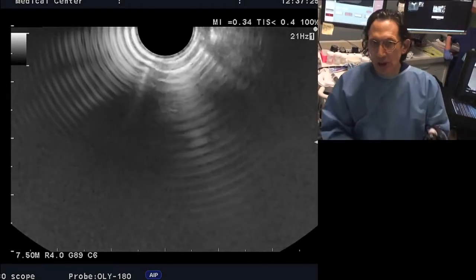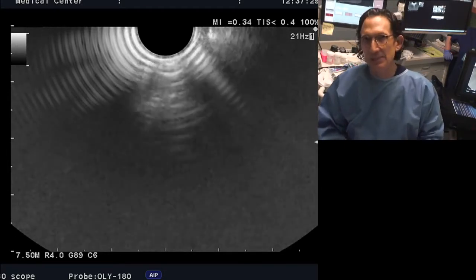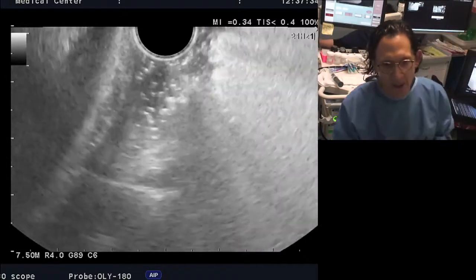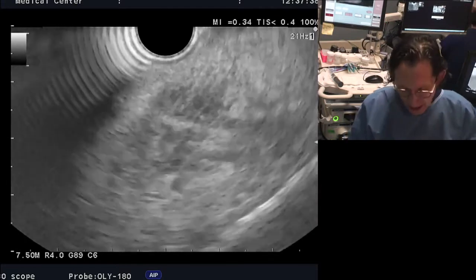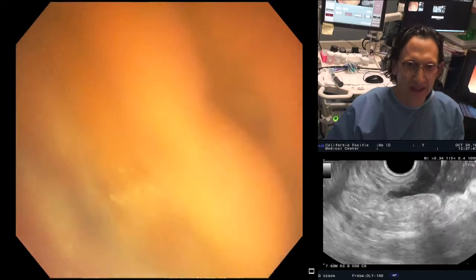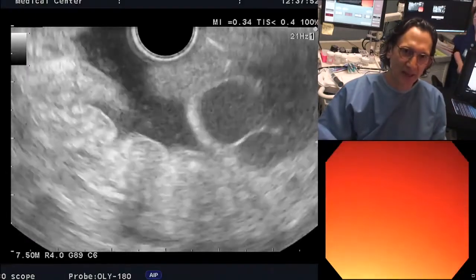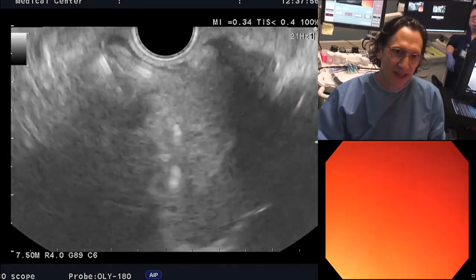Let me just quickly look again, but you need to wait about 5 minutes for the complete polymerization. So it only makes sense to go down and palpate these to confirm that they're hard on instrumental palpation, endoscopic, if you wait 5 minutes. What we can do, though, is look with EUS, and we can see if there are any big ones that we want to additionally inject. And maybe there are. Let's take a look.